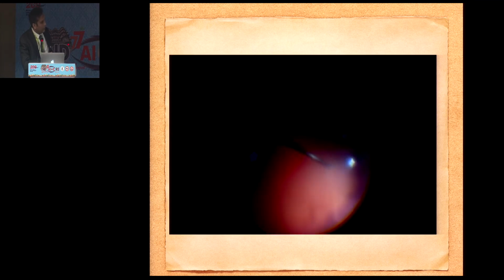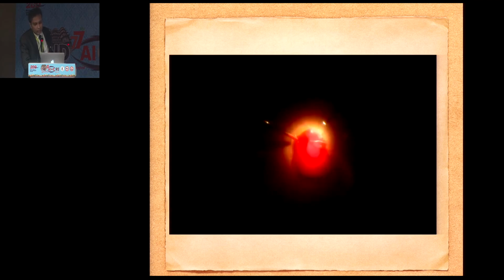Here we opened a real nasty bleeder during the surgery, like this. In this case, nothing worked. So we just increased the bottle height, and you cannot cautery near the disc. We just closed the plugs, waited around 5 minutes, and then went inside. So it creates a clot. It's like a tenacious membrane. And then we dissected it, and the end result looks pretty good.